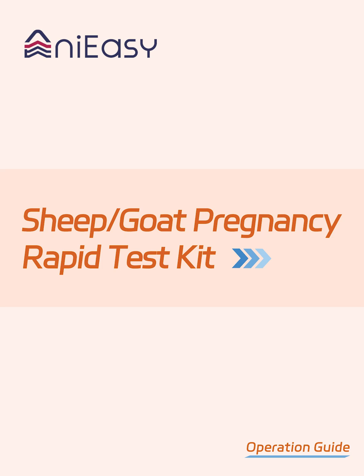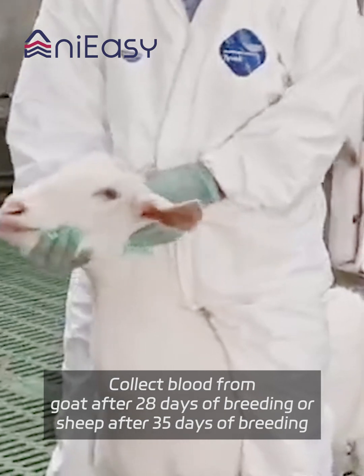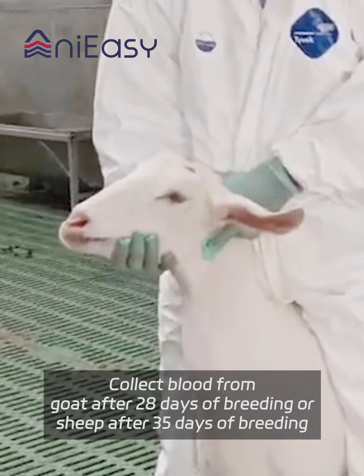Sheep and Goat Pregnancy Rapid Test Kit. Collect blood from goat after 28 days of breeding, or from sheep after 35 days of breeding.